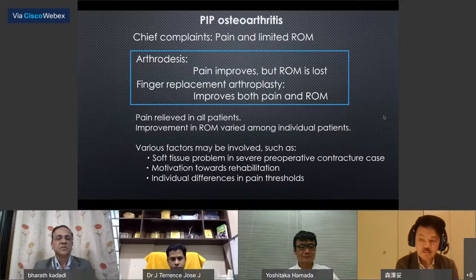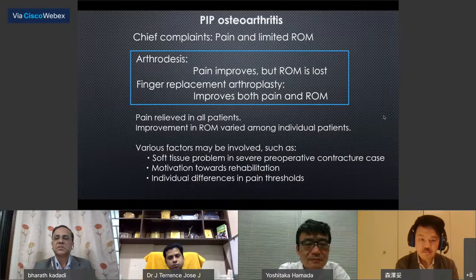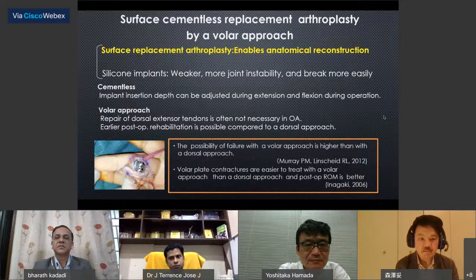This was related to various factors, including soft tissue status, severity of preoperative contractures, motivation towards rehabilitation, and pain thresholds. We use cementless surface replacement arthroplasty by a palmar approach. Silicone implants are weaker, have more joint instability, and break more easily. Surface replacement arthroplasty enables better anatomical reconstruction.